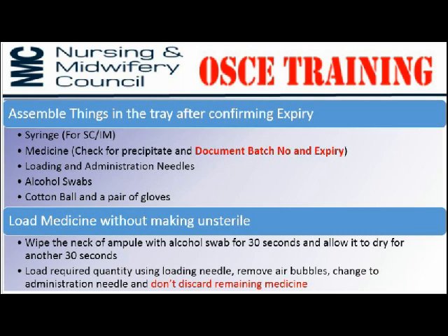So your tray will contain a syringe, the medicine, loading and administration needles, alcohol swabs, cotton ball, and a pair of gloves. After assembling everything, you need to load the medicine without making it unsterile. Wipe the neck of the ampule with the alcohol swab for 30 seconds and allow it to dry for another 30 seconds. Confirm with the examiner that the ampule is ready, cleaned and dried after 30 seconds.